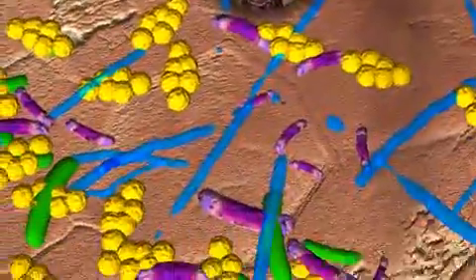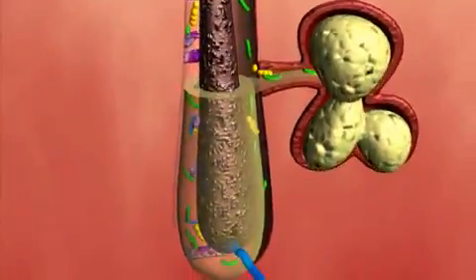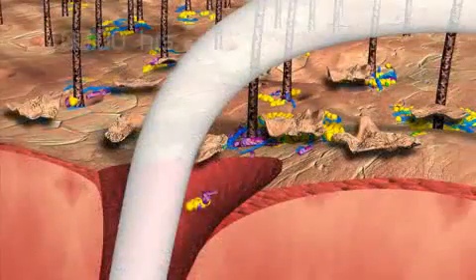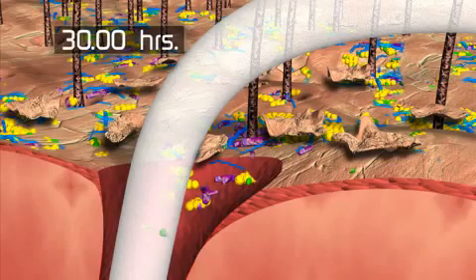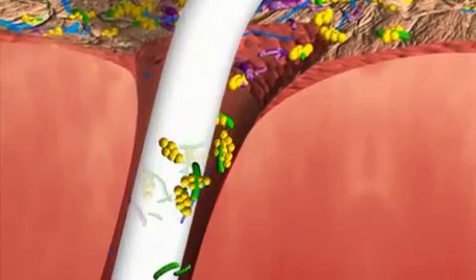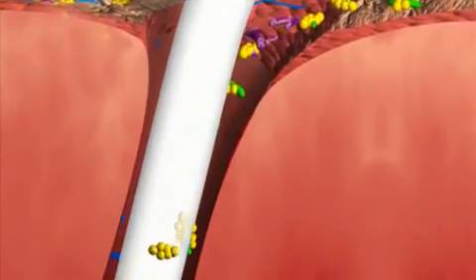Bacteria colonies exist not only on the surface, but below the surface as well, particularly within the hair follicles and sebaceous glands. Skin antisepsis with an antimicrobial such as ChloraPrep will kill bacteria on the surface level, but it never completely disinfects the skin. Recolonization by the resident microflora can occur very quickly. Without continual suppression, bacteria on the skin surface can migrate along the catheter tract, elevating the risk of CRBSI.